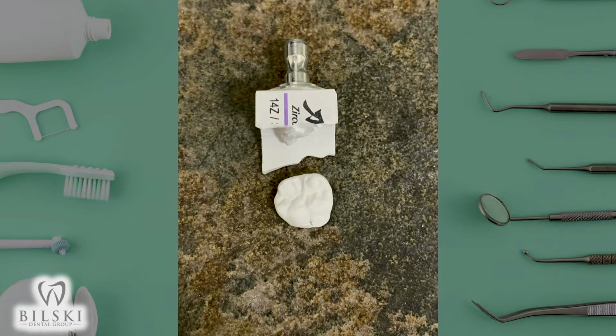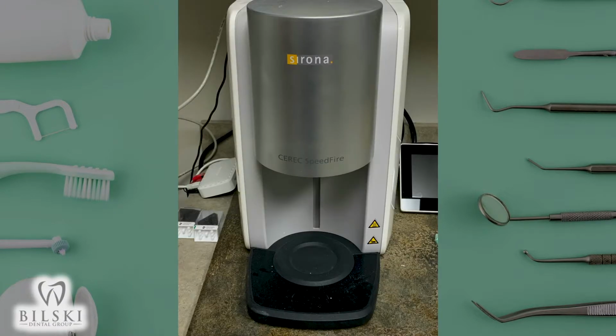Once that's milled, it is sent over to, I call it the Easy Bake Oven. It's a kiln. It's a vacuum kiln. It's well over 1,300 degrees Fahrenheit. It solidifies the crystals that are made in that block, and it's very strong, very durable.